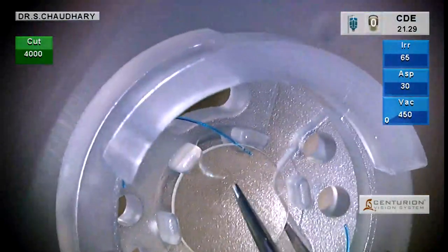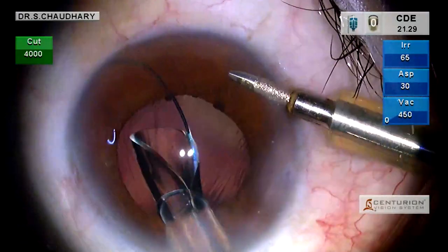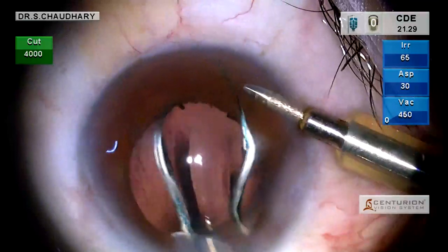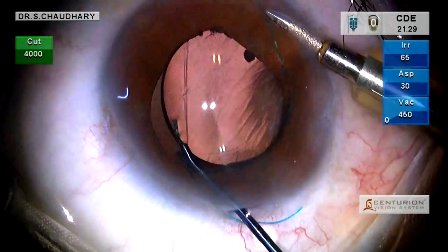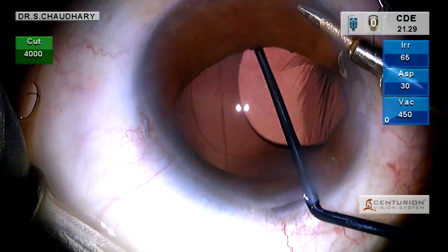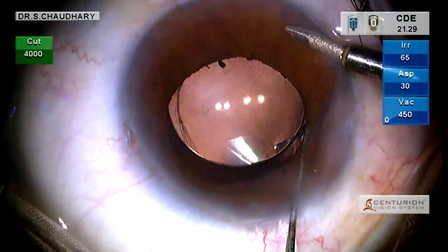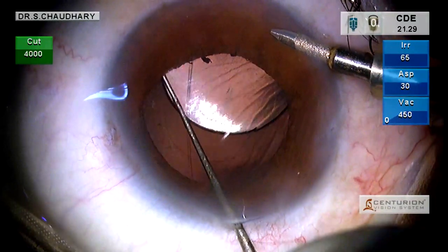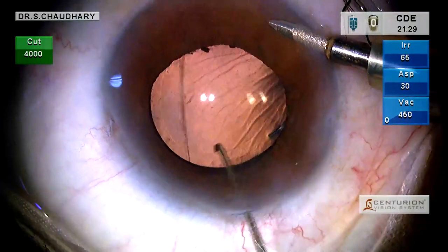We inject a 3-piece IOL under cover of irrigation by the anterior chamber maintainer. The lens opens up over the iris and is dialed into the sulcus. It is sulcus fixated and an optic capture stabilizes the lens in the center.